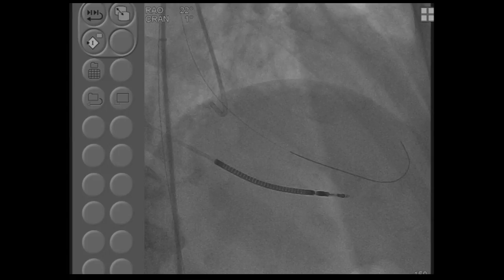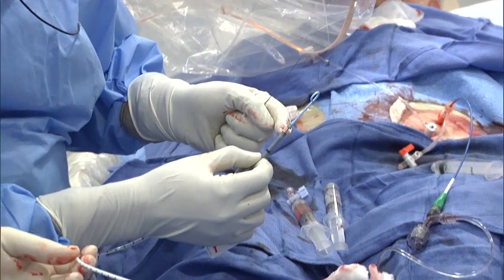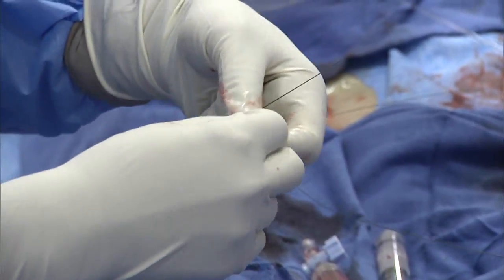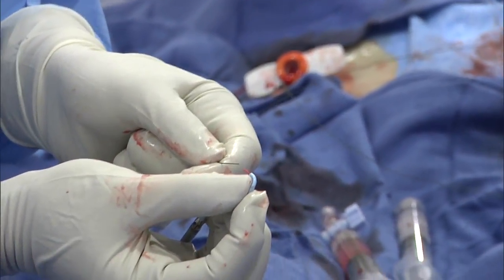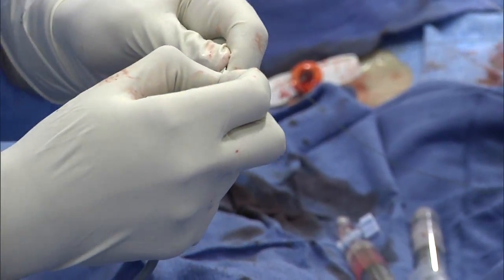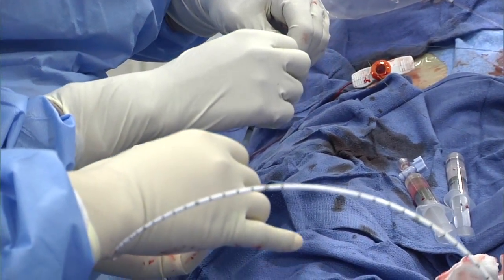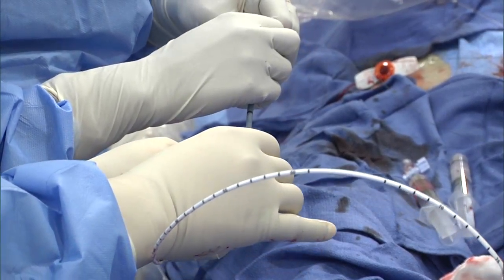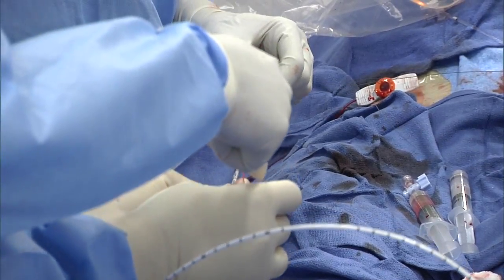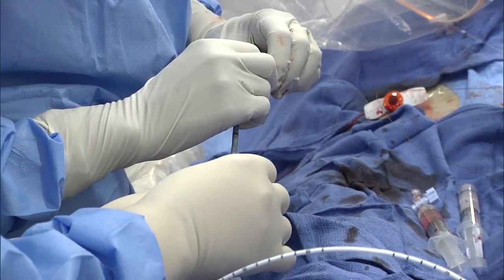This is a 9 French catheter, and you have this pump which is at this level. The modification they had was this red tube, so that as soon as you insert the wire into the pigtail, your wire exits at the right spot. In the past you used to bend it, and so here you do not need it, but it's still not coming. What happened? No, it came out here.